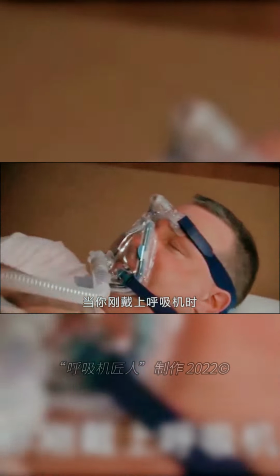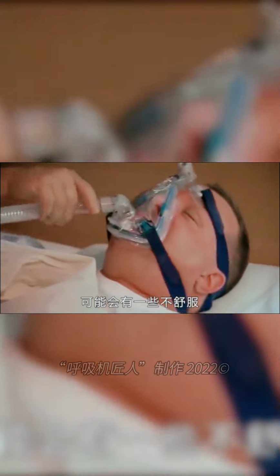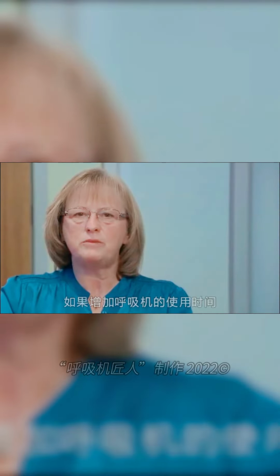Your sleep apnea symptoms should be controlled by your PAP therapy, depending on how many hours you sleep with the mask on your face. When you're new to the therapy and are able to tolerate it for several hours, you may not notice a significant change in your symptoms. As you work towards using the PAP all night, you should notice improvements in how you feel. As you increase your PAP machine usage, you may experience the following positive improvements: less snoring, sleeping more restfully, waking up more refreshed, having less daytime fatigue, and a higher energy level.